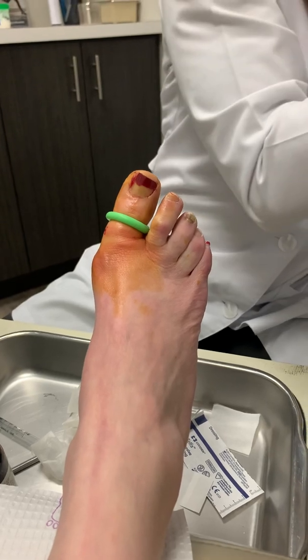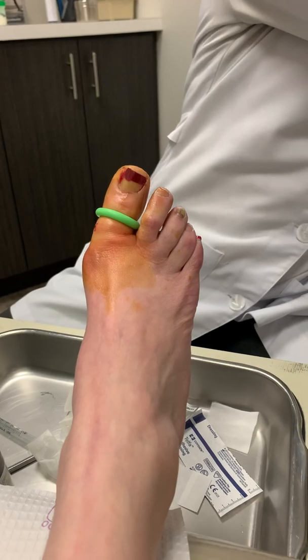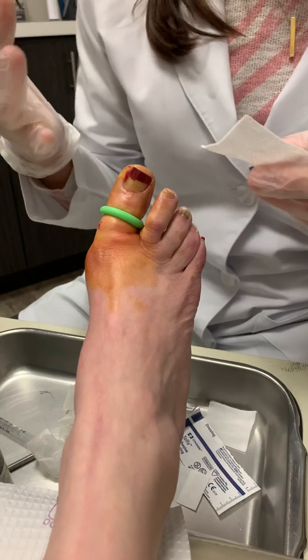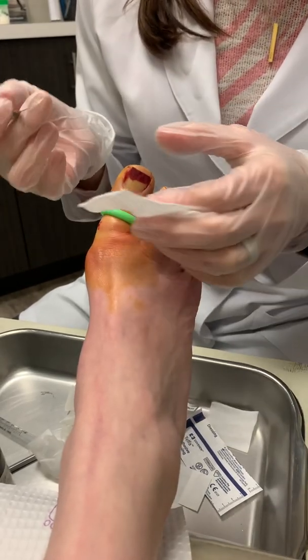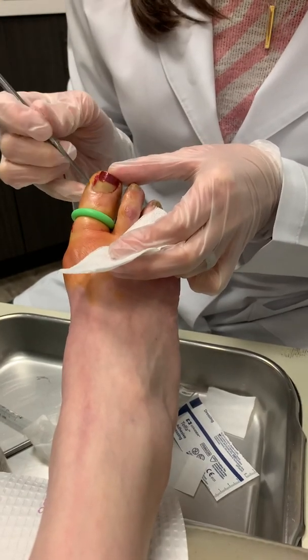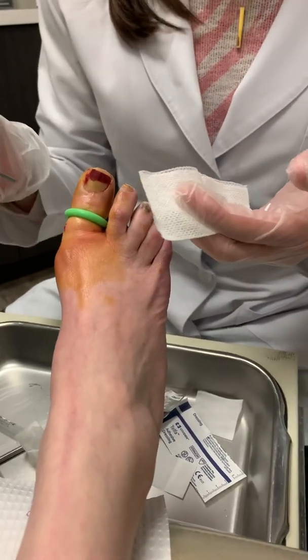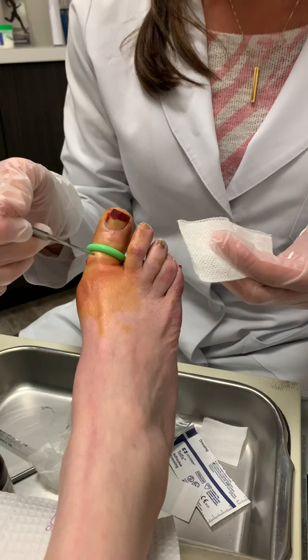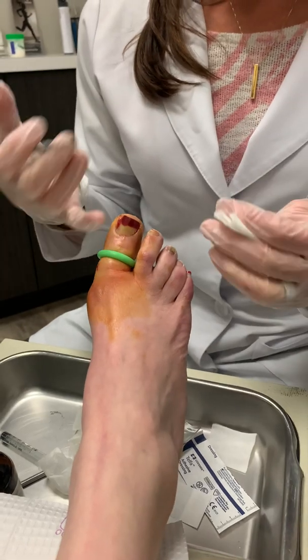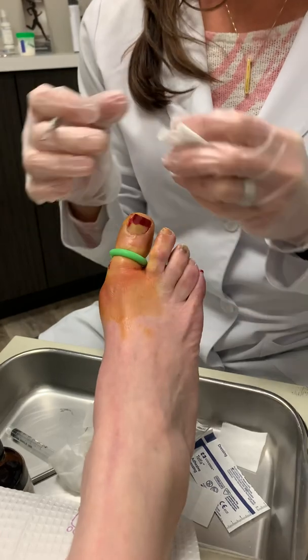We are going to be doing a permanent ingrown toenail procedure today. This patient had been dealing with an infection prior to this, so she's already been on an antibiotic. We want to make sure that you always get rid of the infection before you do the permanent procedure. This edge of nail is digging in quite a bit, and the skin is trying to come up and over it. She's already been numbed up — we've given her an injection into both sides of the toe, and that numbs the four branches of the nerve that goes to the big toe. What you're looking at now is a little tourniquet, which helps so that I can actually see what I need to do.